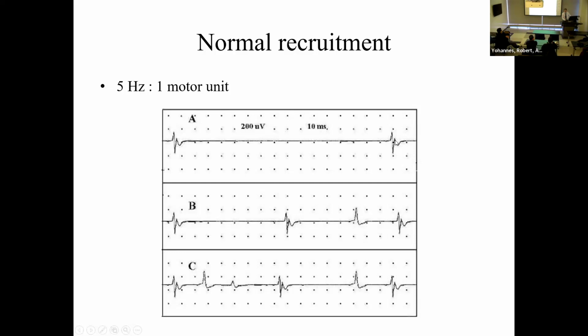What we learned from this is that we didn't need a lot of force. Now we're asking the patient to do a little bit more force. So we're seeing that the same unit here is firing at a higher rate. We see it 3 times on the screen. Well, look what else happened. We see another unit. Remember, we can call them by names. This is John. This is Tom. So John is working here, calling for Tom. Tom is coming to help.